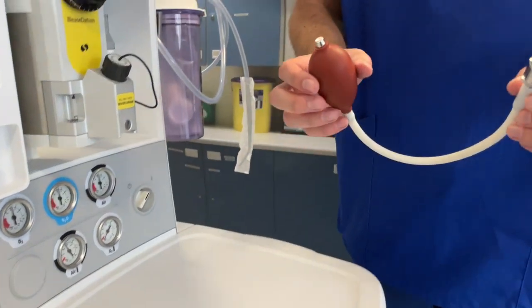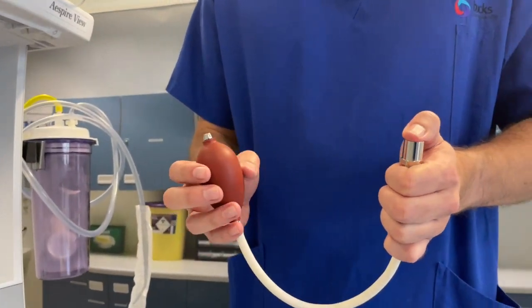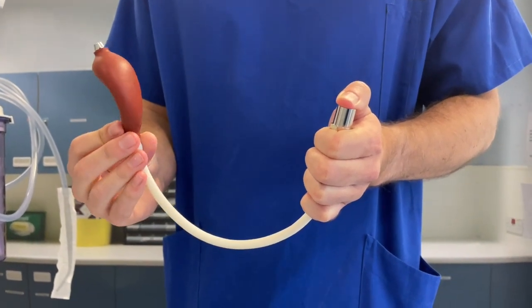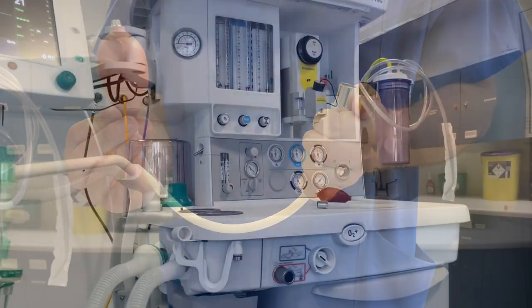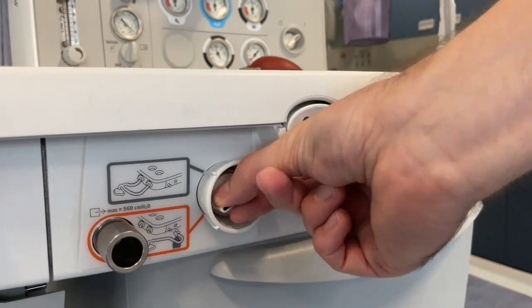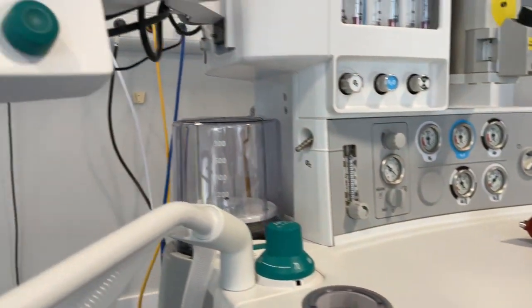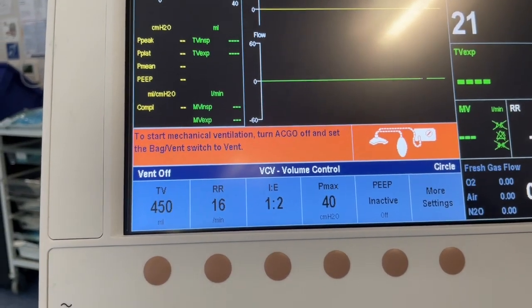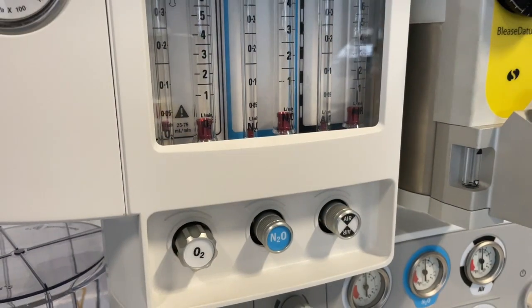This test allows us to check for leaks in the rotameters, the back bar and the vaporizers, and it utilizes a negative pressure test balloon. First engage the auxiliary common gas outlet — this is achieved by flicking the switch on the front of the machine. Some machines will sound an alarm to draw attention to this. When testing the rotameters in this way it is essential that they are turned off. If your machine has a residual flow then the power to the anaesthetic machine will have to be turned off to complete this test.